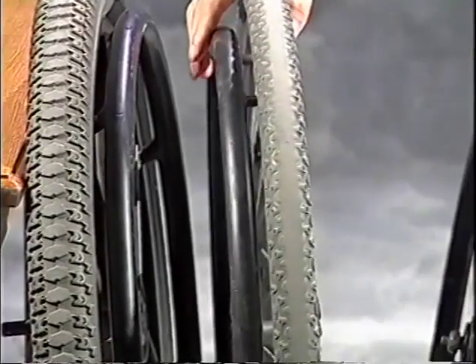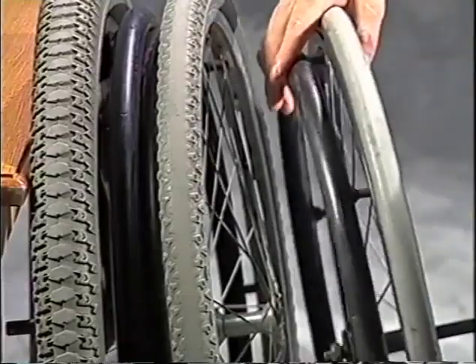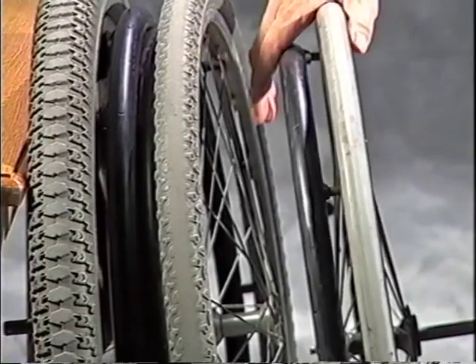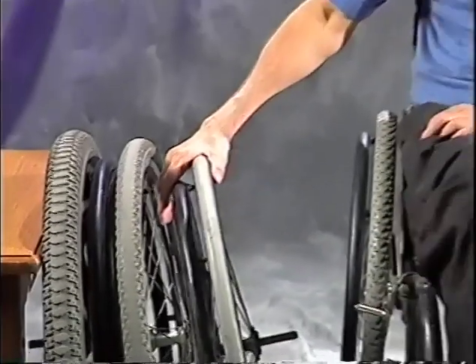The intermediate tire sort of does both worlds fairly well, and the high pressure tire is very good indoors, but loses it on the soft surfaces. So those are your three basic choices.